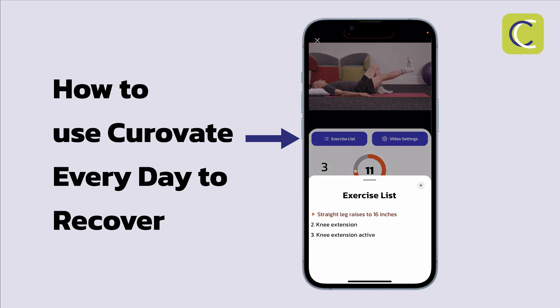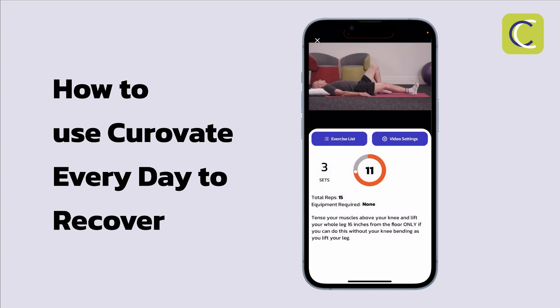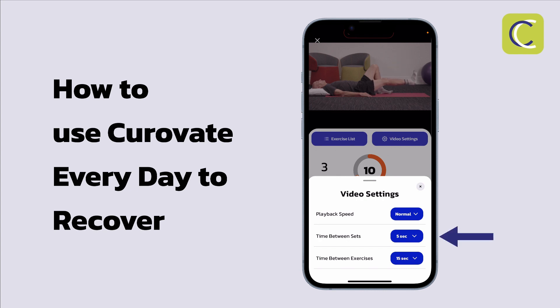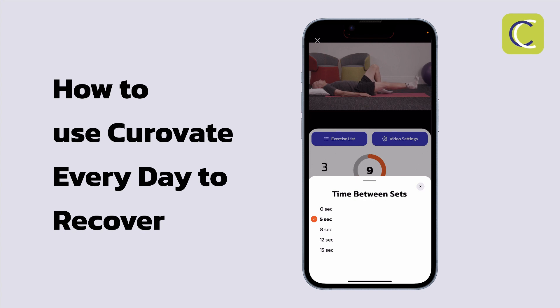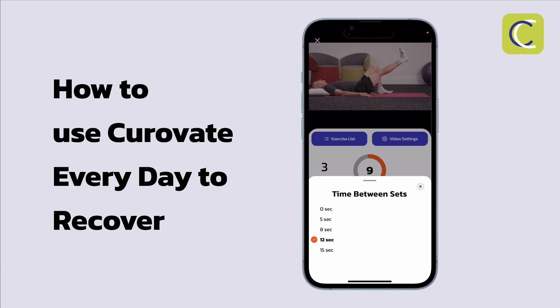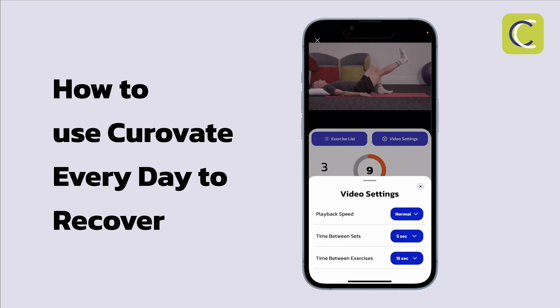There are a few things on this screen to review. I can take a quick look at my exercise list — I'm currently on leg lifts, the next exercise is knee extension, and the one after that is knee extension active. I can also modify some of the video settings. Probably the most important is the time between sets: after one set of leg lifts, how much time do I need? I may find I need more, like 12 seconds, or as few as 5 seconds between sets.